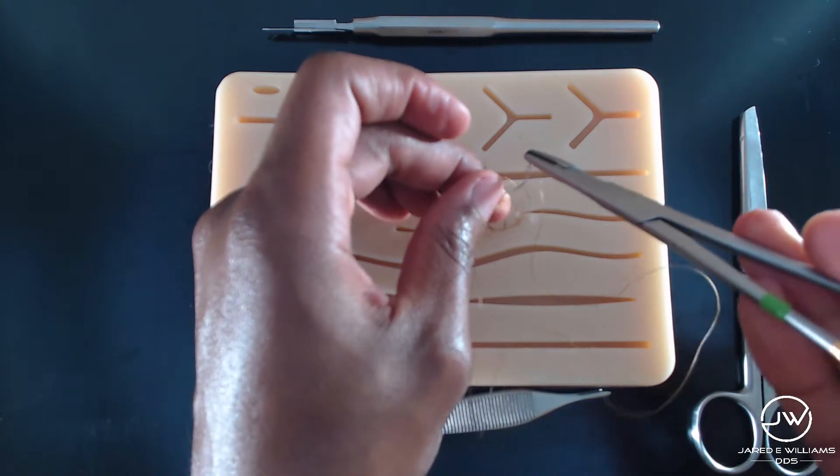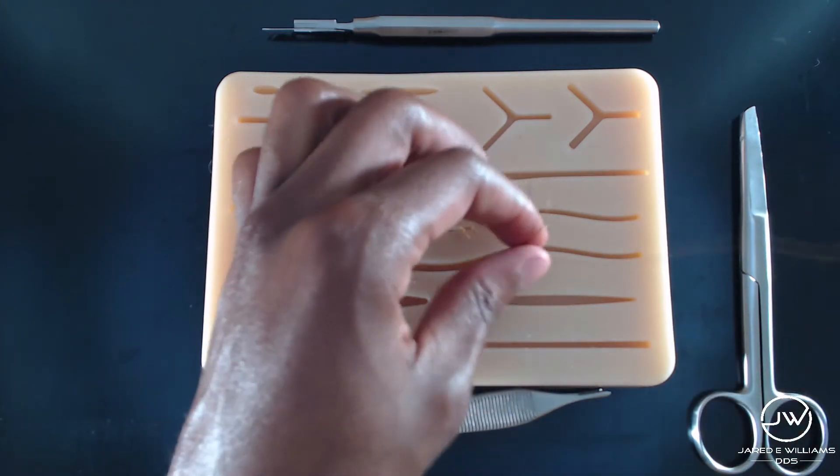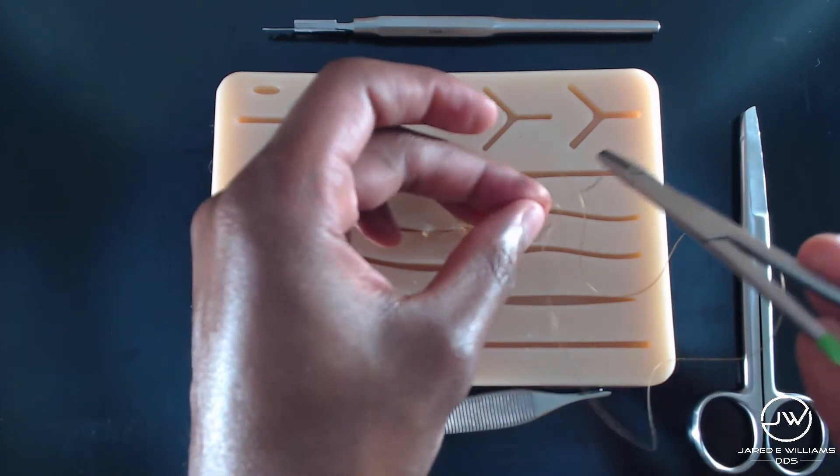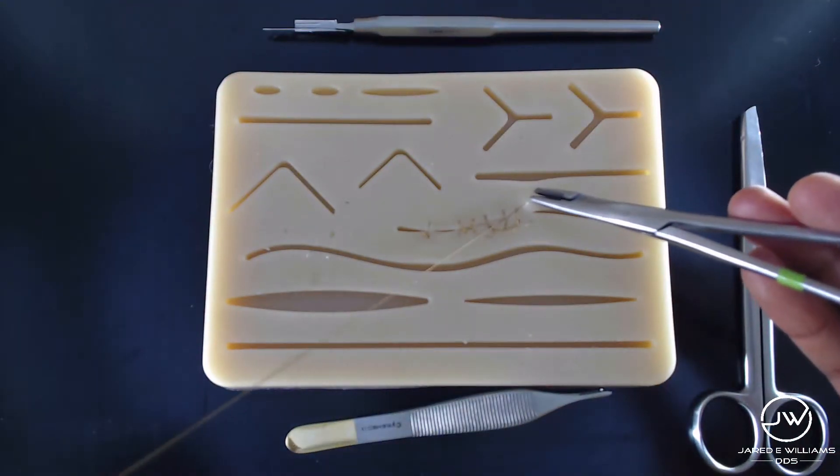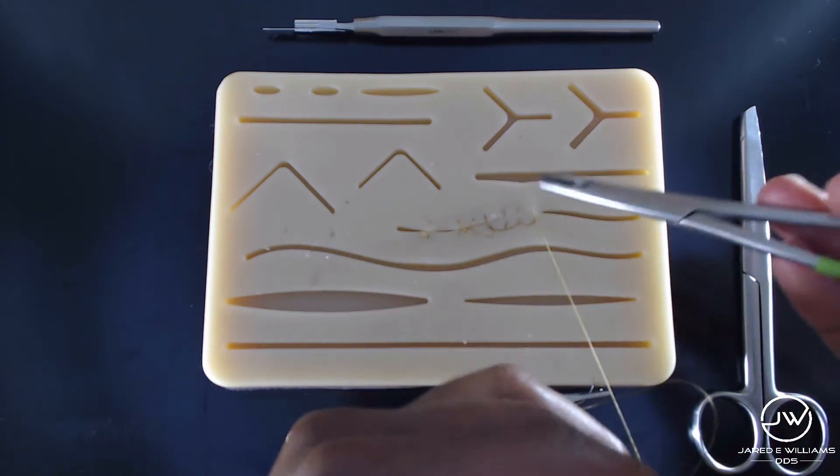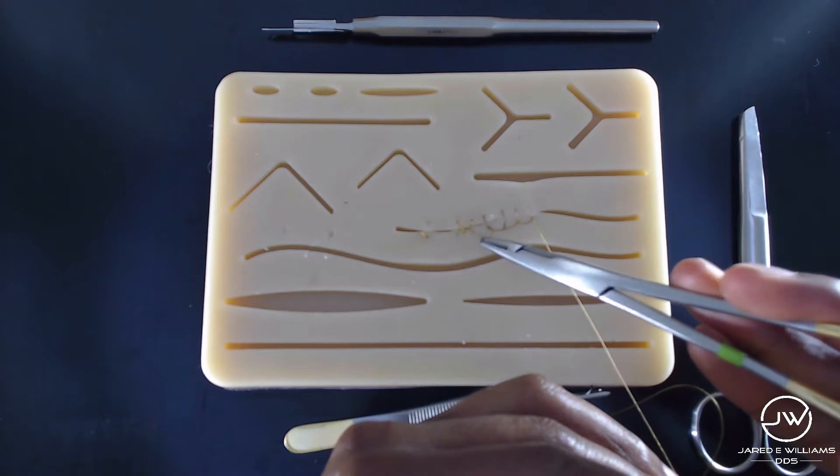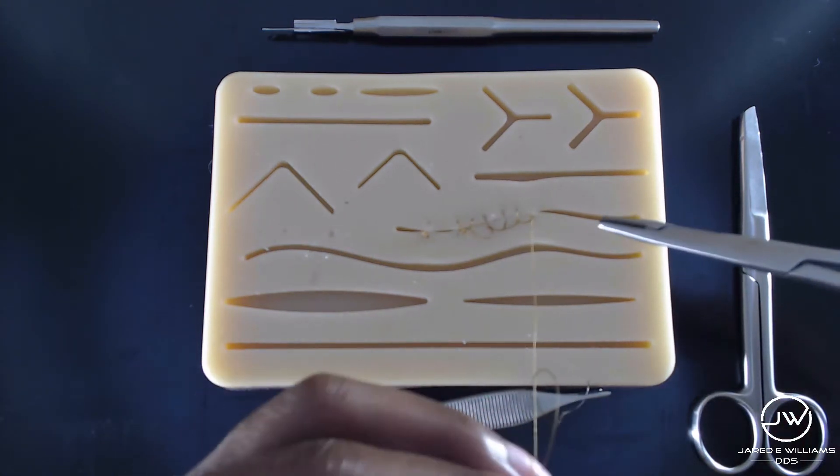Take the back of your suture, pass it through. And you see the locking there. And I wanted to leave this in here. I'm not going to edit this out. But I wanted you to see what the difference is of a short tail versus a long one. The knotting happens and then it tends to be an issue.